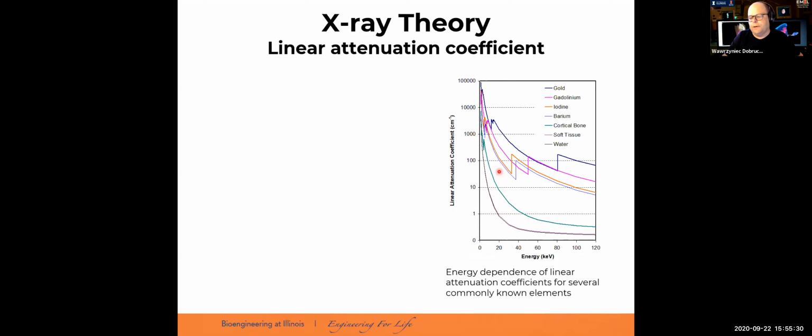Then we have some of the elements, for example iodine, barium. Hold on, there is a chat message. Is CT angiography and contrast enhanced CT the same thing? Yes, it's exactly the same thing, with the exception that angiography, as the name says, is associated with vascular imaging. But you can do other contrast enhanced CT which is not focused on vascular imaging. So CT angiography is a part of contrast enhanced CT.